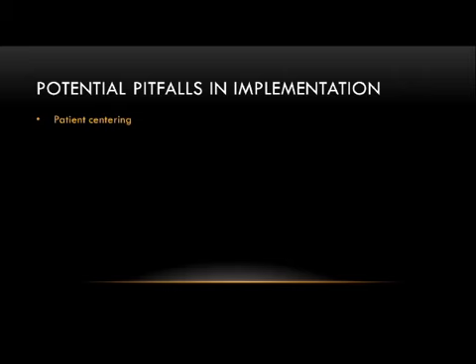So if you want your most accurate SSDE information for the dose index registry, and you want your tube current modulation to function properly, and you want the dose distribution throughout the patient to be proper, and you want your recon field of views to make sense, please center the patient.